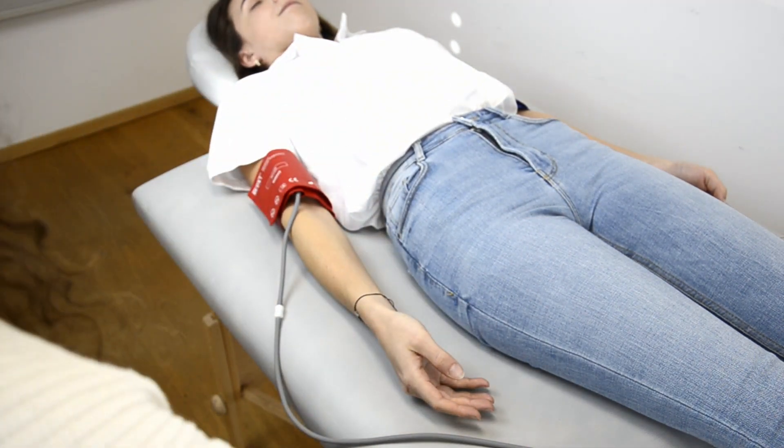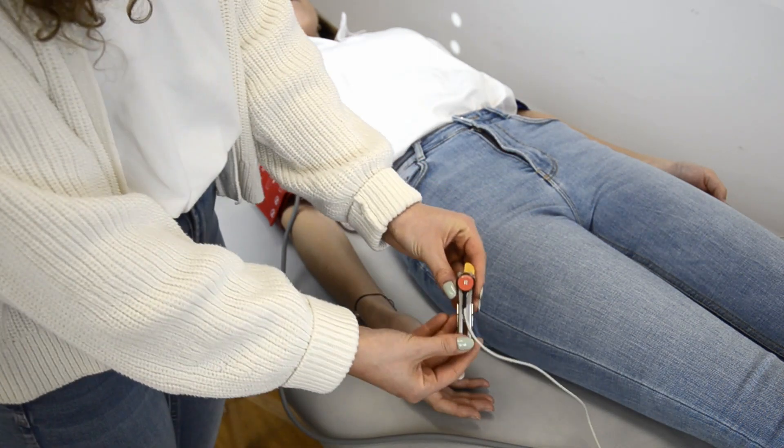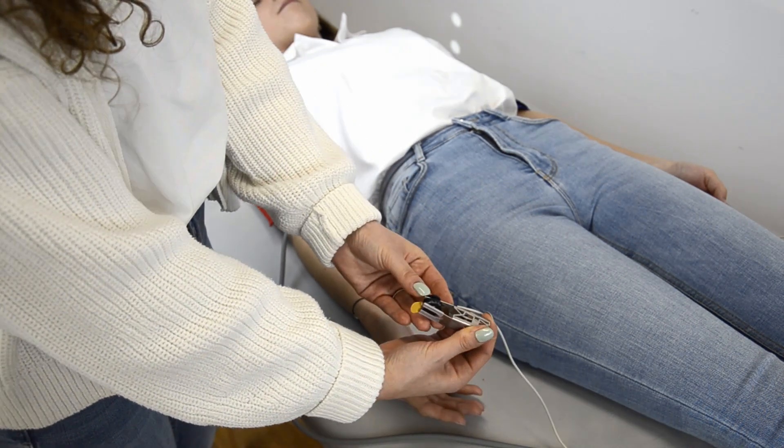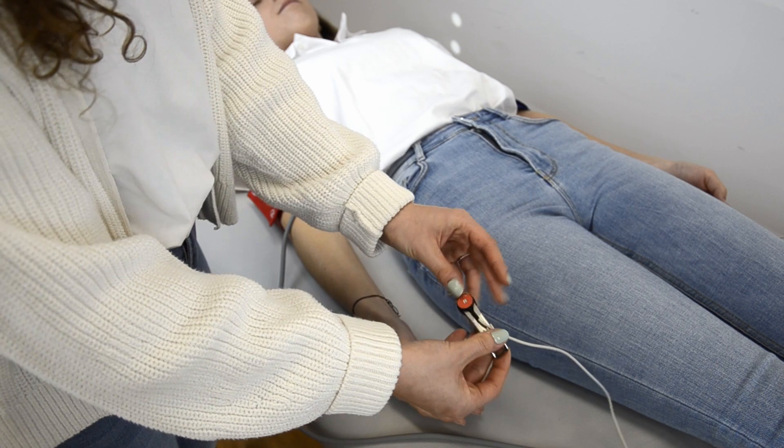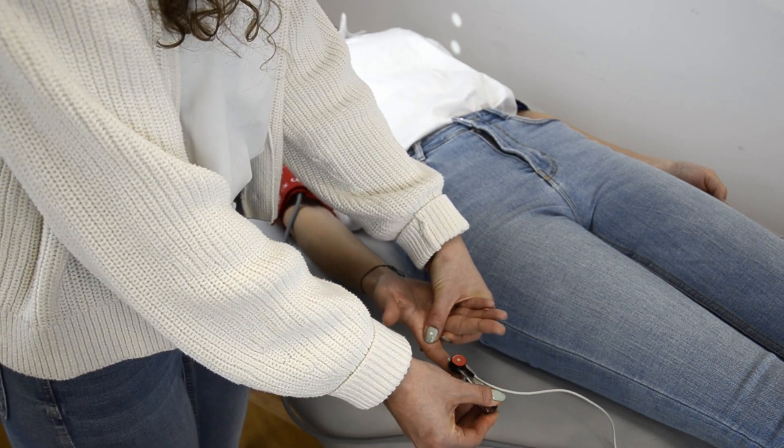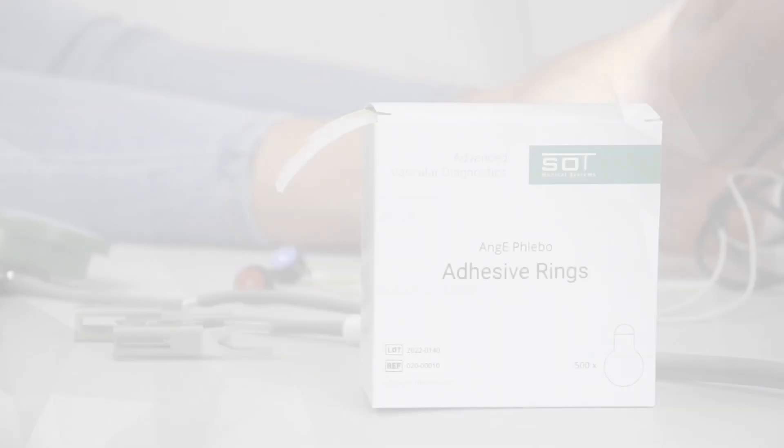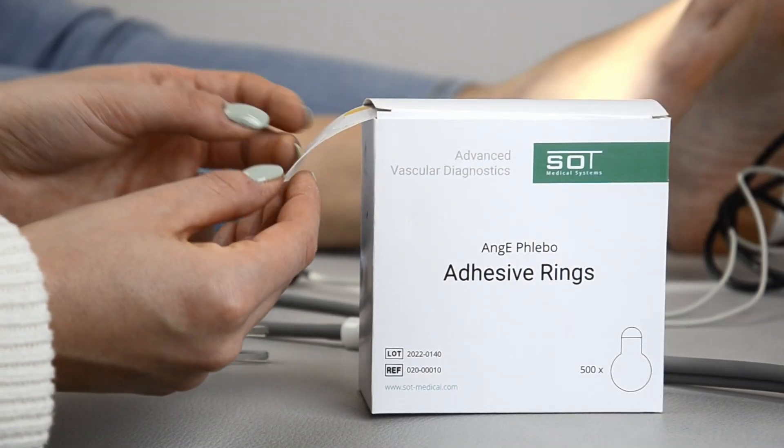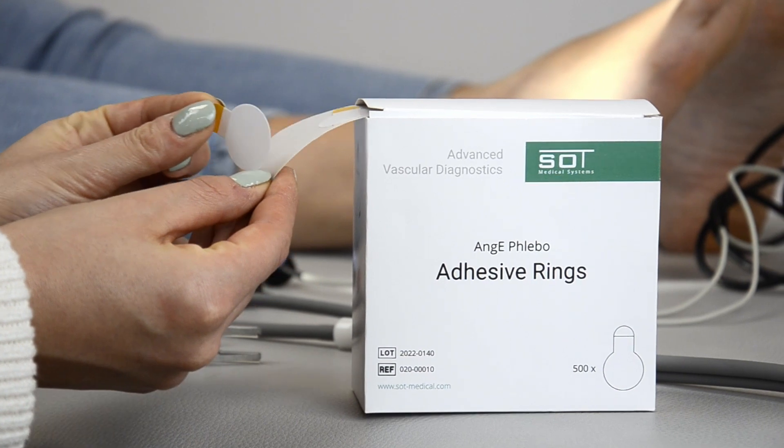Place the optical sensors on the fingers and ensure that they have full skin contact. Make sure that the right sensor is placed on the right side of the patient and the left sensor is placed on the left side of the patient. For hygiene reasons, sensors are always applied with adhesive rings.